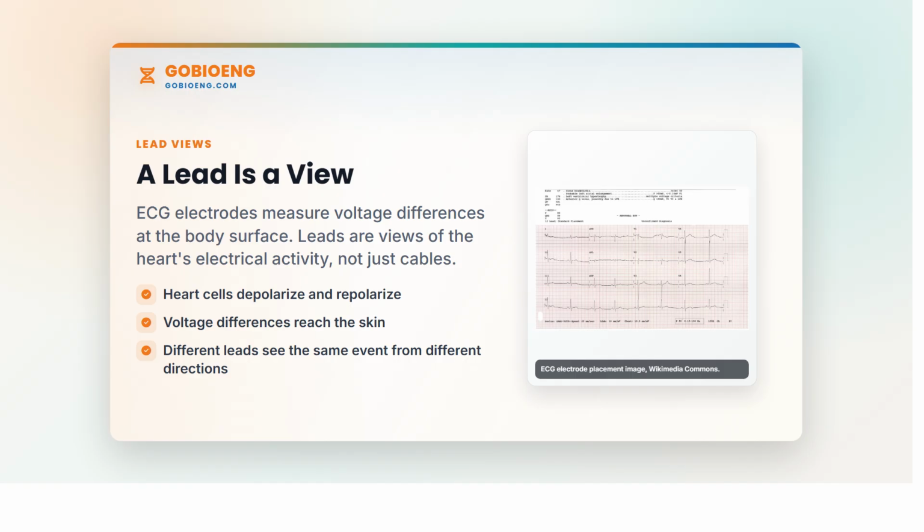But students should be careful not to overclaim. These waves are body surface voltage patterns. They are not a direct movie of mechanical heart movement. Interpretation always depends on the patient, the recording quality, and the lead view.